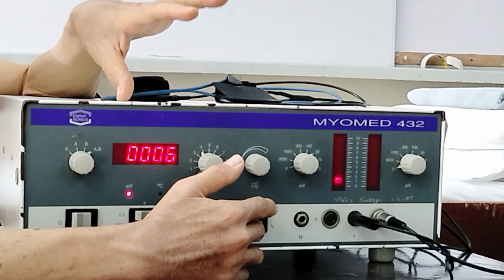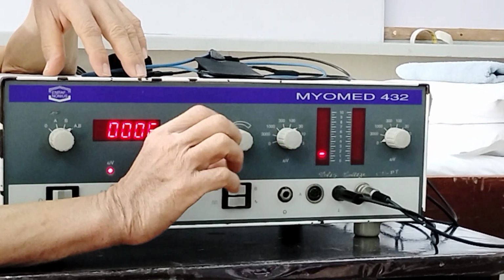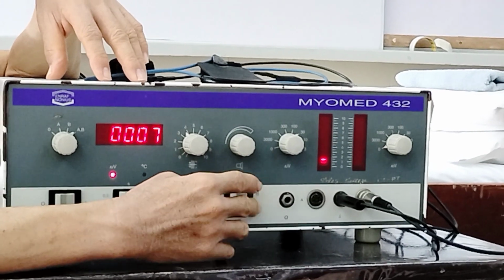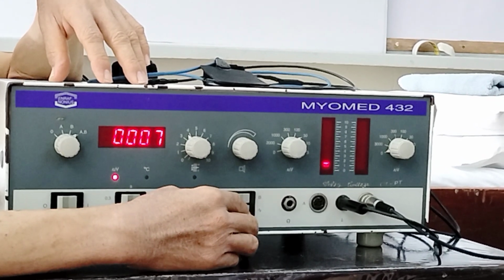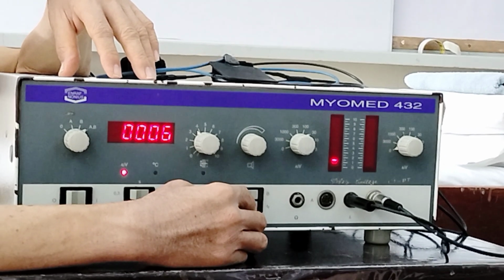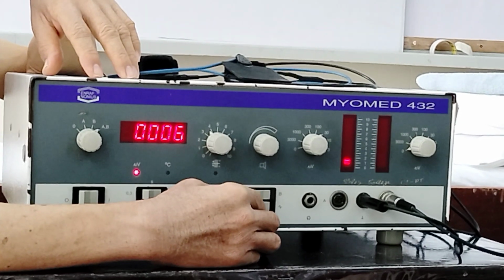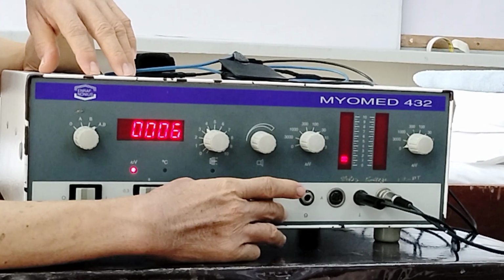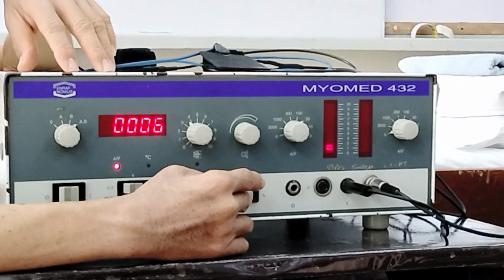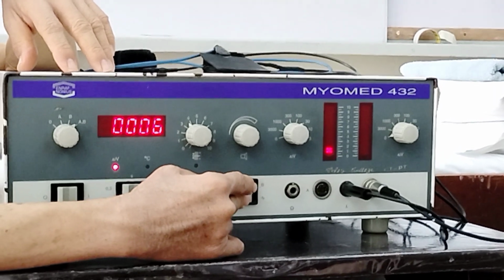So there, you would expect that as the patient contracts, the sound will become stronger. Comparing the two, the sound is nicer to hear with the rectified. It is not irritating to the hearing if we use rectified, as compared to the unprocessed sound, which is irritating. So it's up to you to choose whether you want the rectified or unprocessed.